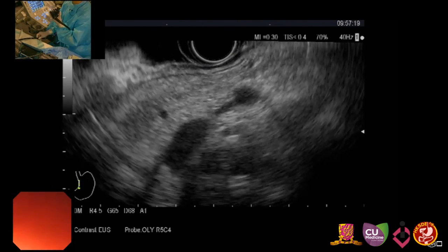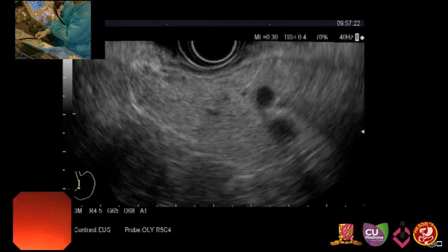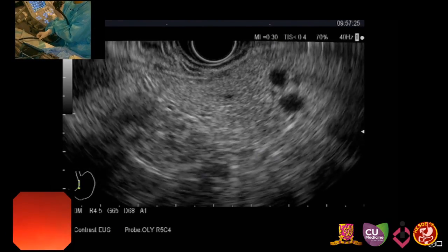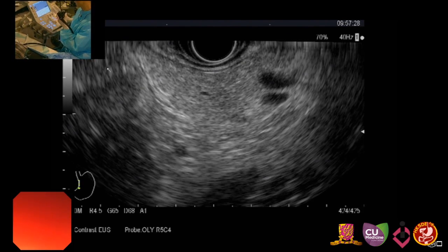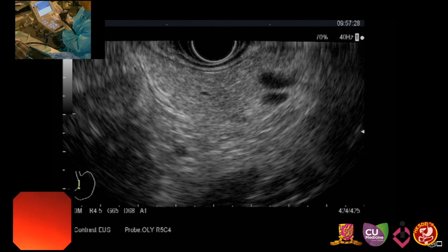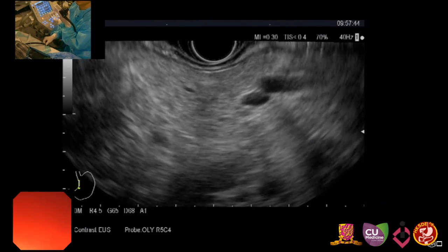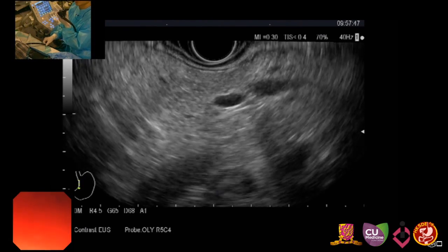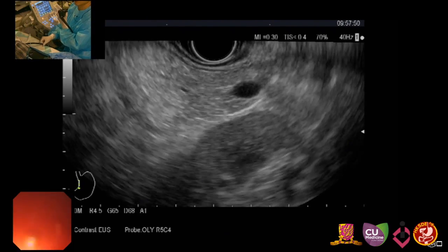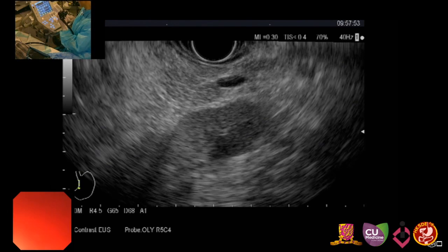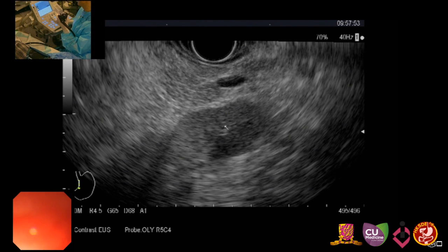If I rotate the scope clockwise, I can trace the pancreatic duct and parenchyma to the tail area. These two prominent structures are vascular structures — the splenic vein and splenic artery. The splenic vein and splenic artery always abut the pancreatic parenchyma, so we can trace the pancreas and pancreatic duct with the splenic vessels together. Now I'm reaching the left renal area — we can see the left kidney here, including the cortex and medullary area.